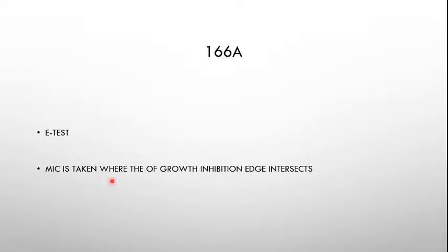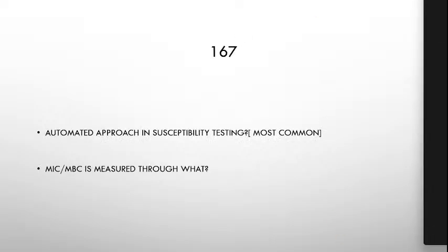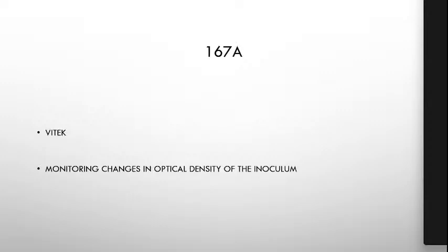So, MIC is taken at the edge where it intersects. Okay? Okay ba yon? Gets nyo? Kung paano gamitin ng automated approach in susceptibility testing. Most common is Vitek. But now we have BD Phoenix, and we're going to talk about microbiology automation at the end of our bacteriology chapters. Okay? So, be mindful lang.